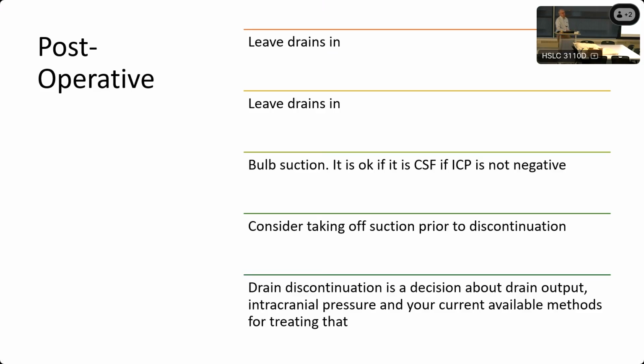Post-operatively, I believe very firmly in leaving drains in at least 48 hours, because you don't want to be pulling these drains at the same time as you're really aggressively managing ICP and running into all sorts of trouble. So I put it to bulb suction. It's okay if it's sucking CSF, as long as the ICP is not negative. I typically will take it off suction prior to discontinuation. Drain discontinuation is a complex decision about drain output, intracranial pressure, and different available methods for treatment.